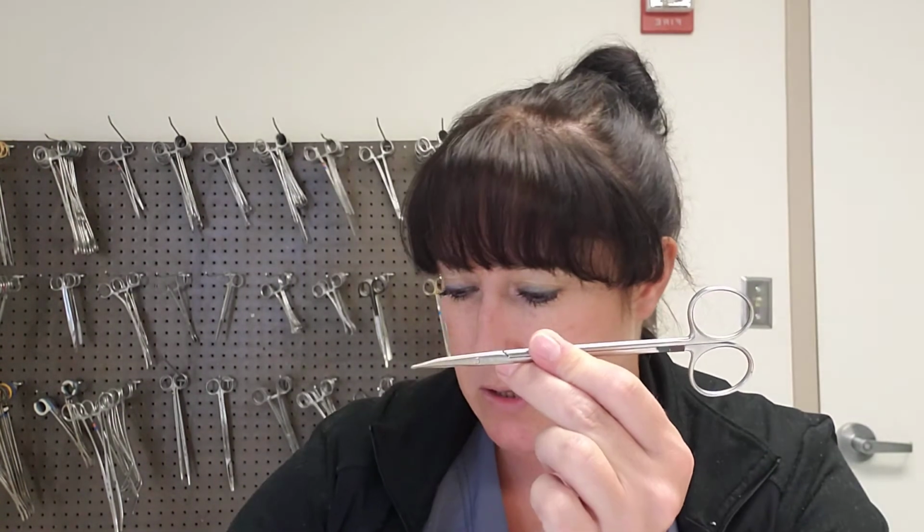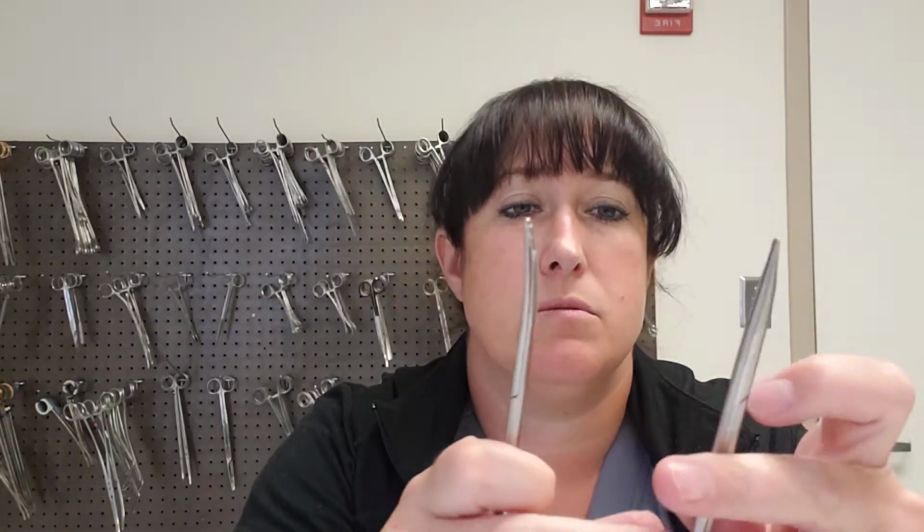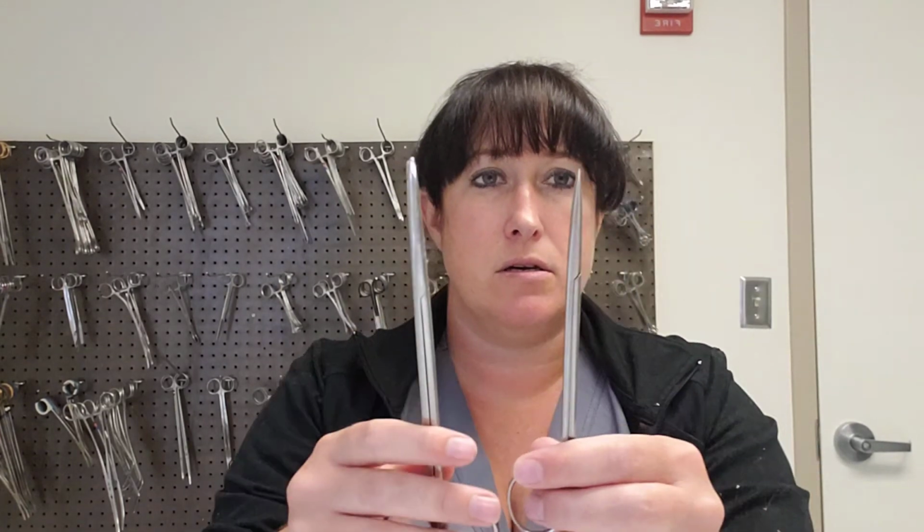Let's look at these. Now, at first glance, you may think these are just more Mets. They're very similar at first, but when you really start looking at them, they're not. These are thinner, and the tips are different. It tapers in a little bit on these tips. These are called tenotomy scissors.